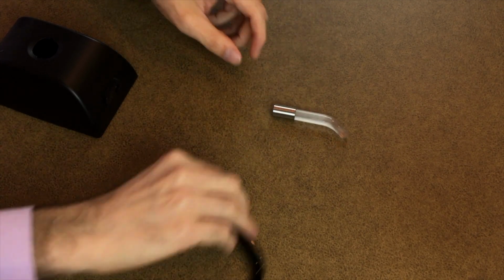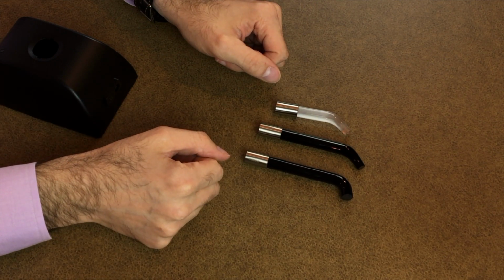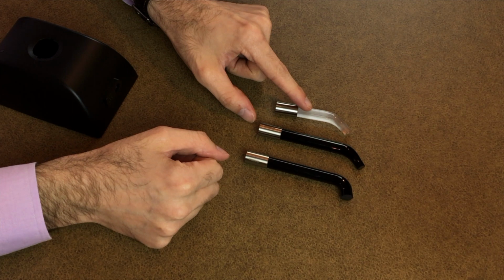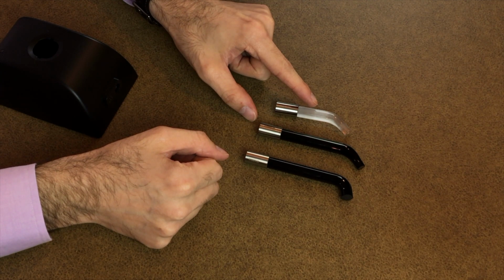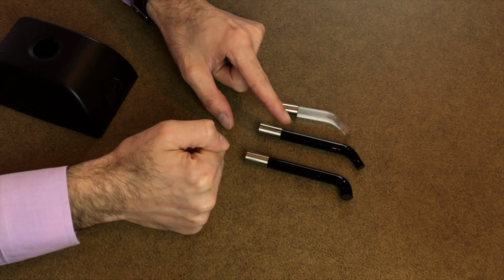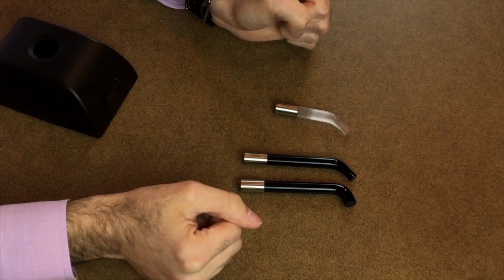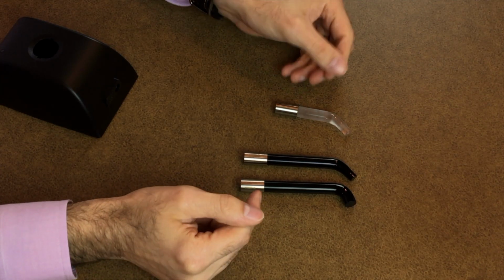As far as the tips are concerned, we've got three tips. We've got the regular clear short turbo tip, and that's got 8 millimeters of diameter at the end. We've got a little bit longer one, and this is coated in black so that light isn't leaking through. And then we've got the standard tip, which has an 11 millimeter diameter at the end. Now these two tips I got from the manufacturer, but they do not come with the unit, but they are extra tips that are available.